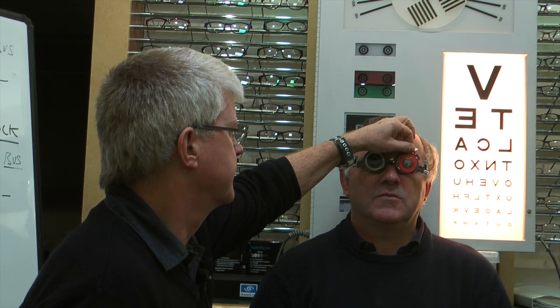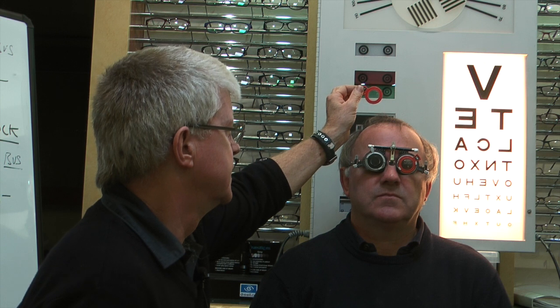Now we're going to try and offer up a minus 0.50 to see whether that makes any improvement. Alan, can you tell me whether the lines look sharper with the extra minus 0.50, or whether it just makes the letters a bit darker? No, it's no clearer at all — it's worse, if anything. So that minus 2 is better. Let's try with a minus 0.25, just a little bit of extra minus, just to double check. How does that feel? Not much different actually — I don't need it, it's about the same. So minus 2 in the left eye.